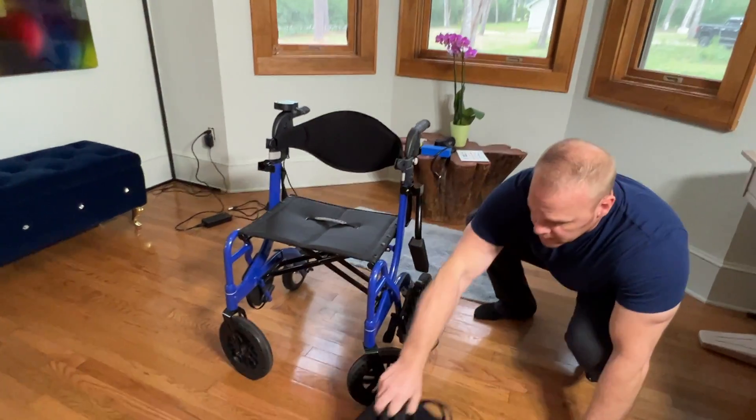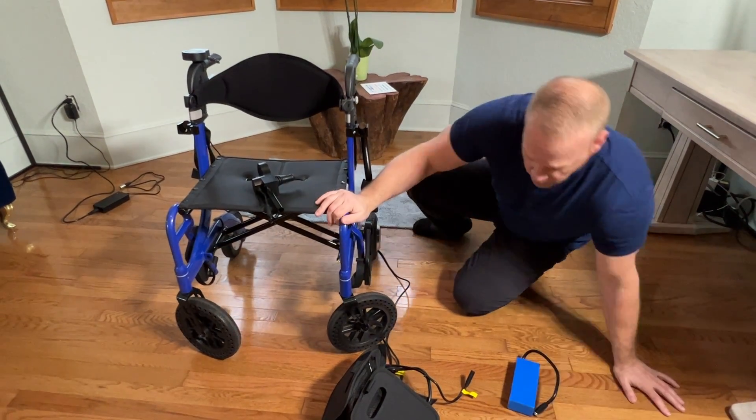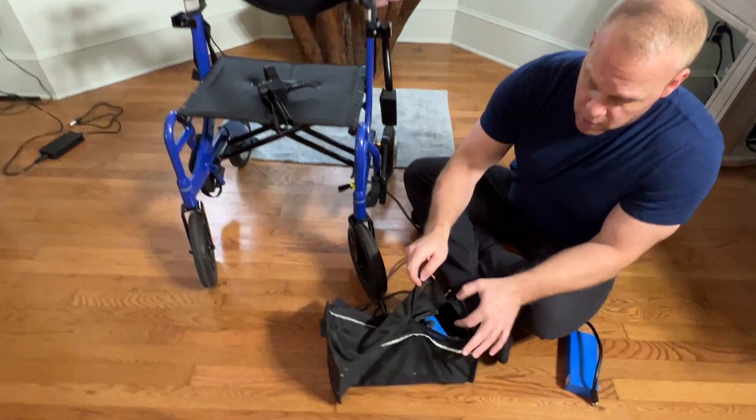There are a few things that make this Wheelator exceptionally unique. We have a joystick that we'll be putting on later on. This video is going to get a little bit technical. Now this basket does not need to be taken off every single time.